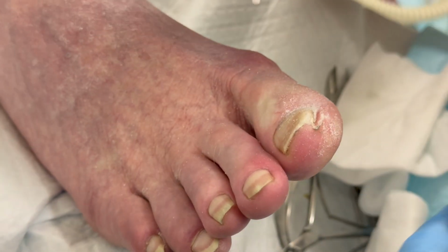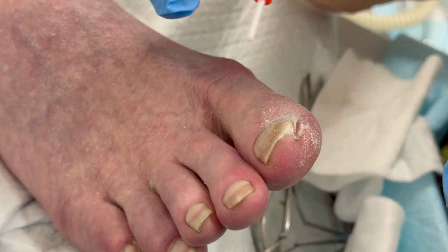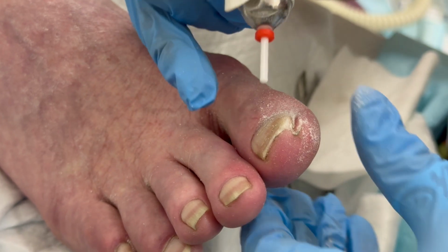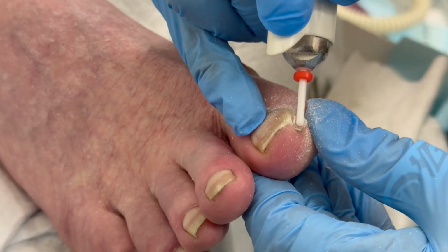And anybody who's using this kind of equipment needs to do it on themselves, because eventually you're going to press too hard and you'll know exactly how it feels. It's a little burning sensation, not pleasant, but you just let off and it goes away very quickly. So I'm trying to remember that so I don't cause John to have that problem.